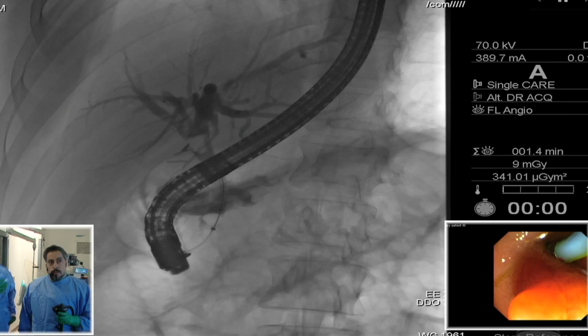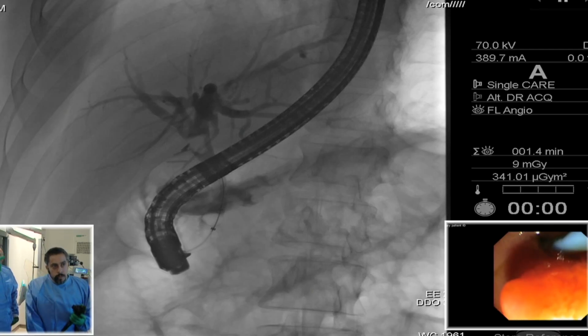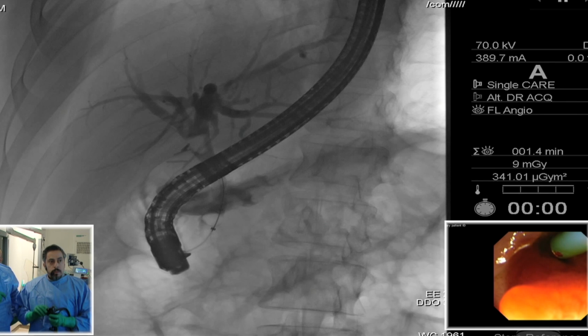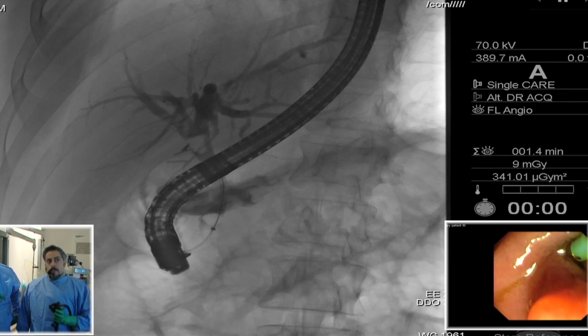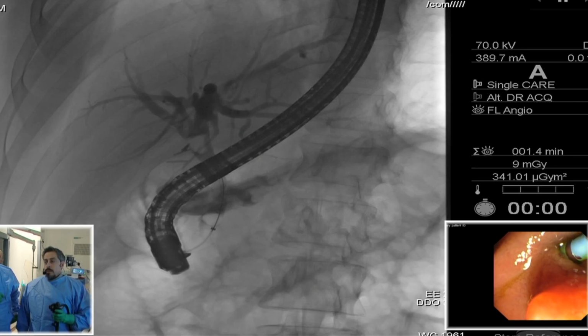So I think this is the last option for the patient before managing by endoscopic management for CBD stones. I think we will have balloon sphincteroplasty. And as you see in the endoscopic imaging, I think the patient has already had a trial of endoscopic balloon sphincteroplasty to facilitate the introduction of the cholangioscope probe.